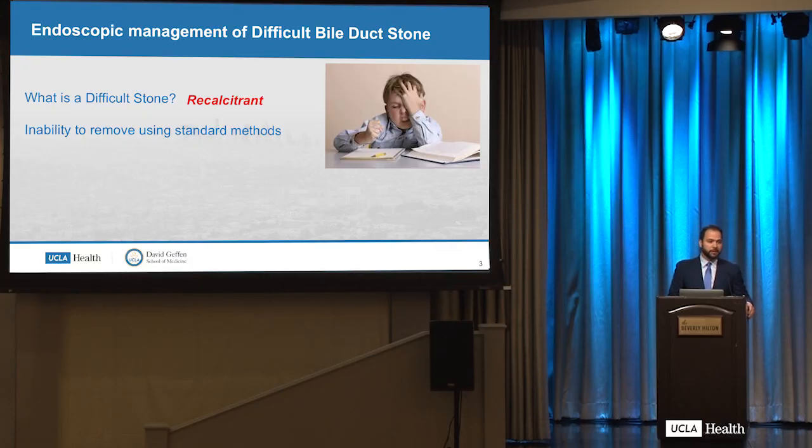Thank you very much, Dr. Kim, and thank you everybody for being here today. We're going to talk about removal of difficult CBD stones. So ERCP has been the treatment of choice for CBD stones for more than 30 years. However, some stones tend to be difficult, or sometimes we call them recalcitrant. And that is defined as the inability to remove those stones using your standard ERCP with biliary sphincterotomy.